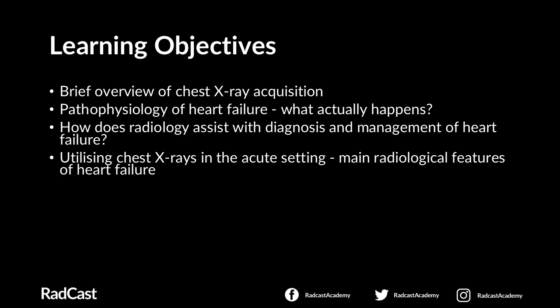Then I'll talk a little about the role of radiology within the diagnosis and management of heart failure, and how there are various radiological modalities that can assist us with identifying and evaluating the severity and even the etiology of heart failure in a particular patient. And then I'm going to bring us on finally to the fundamentals of how to identify features of a chest x-ray that might point towards a heart failure diagnosis, and of course tie this back to the pathophysiology of heart failure.